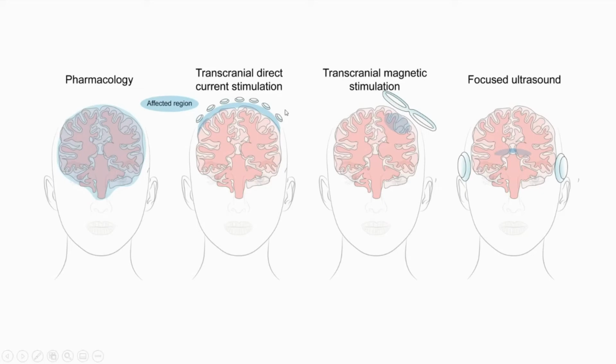So I'm sure a lot of people, especially joining the BrainBox seminar, are familiar with TDCS and TMS, which are attempting to address both the temporal and spatial aspects or problems with drugs. But one of the major problems with them is that they're limited to these sort of superficial layers of the cortex for the most part. So focused ultrasound is exciting for a lot of people, including myself, because it allows us to start to reach these little deep brain areas and to hit the targets that we sort of love and hold dear.